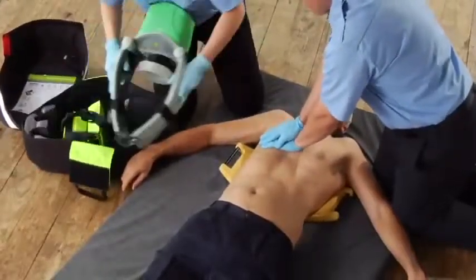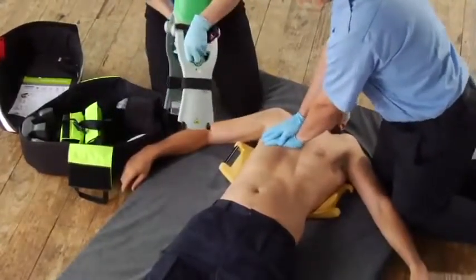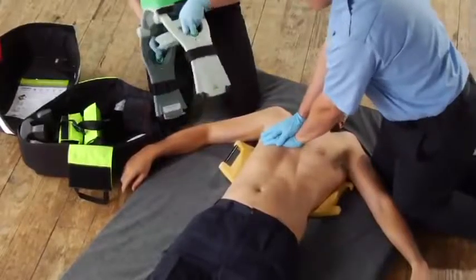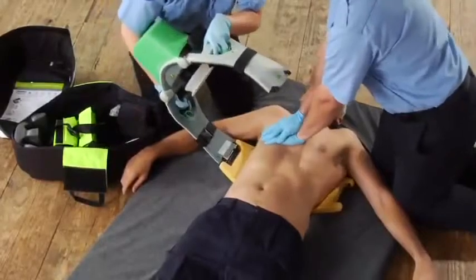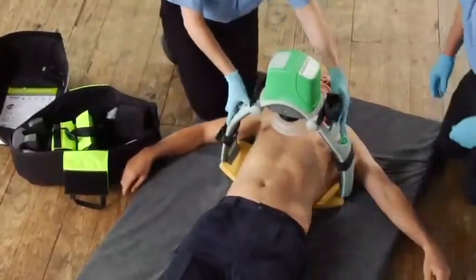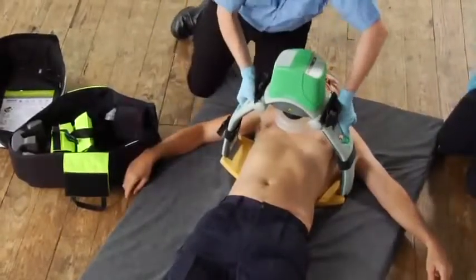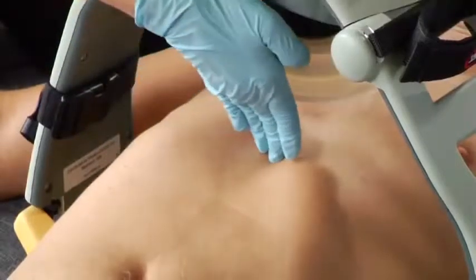Lift the upper part of Lucas out of the bag by the leg handles and it springs open. Pull up on the release rings until the claw locks open. Click the closest leg onto the back plate — keep fingers clear. Then stop manual compressions and lock in the other leg. Pull up on both legs to make sure they are locked into the plate — that's very important. It's also important to make sure you position the suction cup correctly for effective compressions and to avoid serious patient injury. Center it on the sternum with the lower edge of the cup just above the end of the sternum.